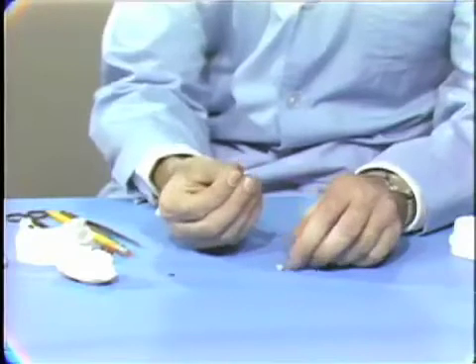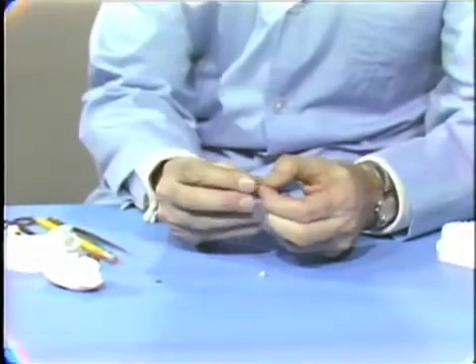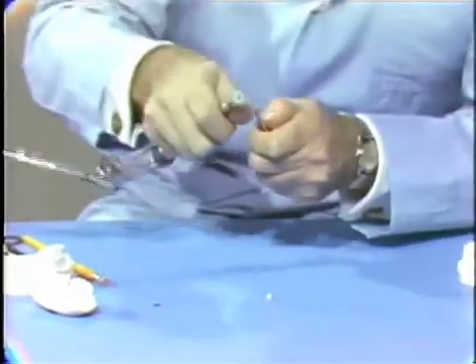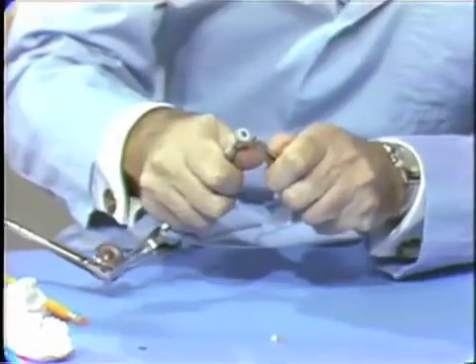The backing is removed from the facing, and with a suitable carborundum stone, the 45-degree bevel is established around the periphery of the backing.